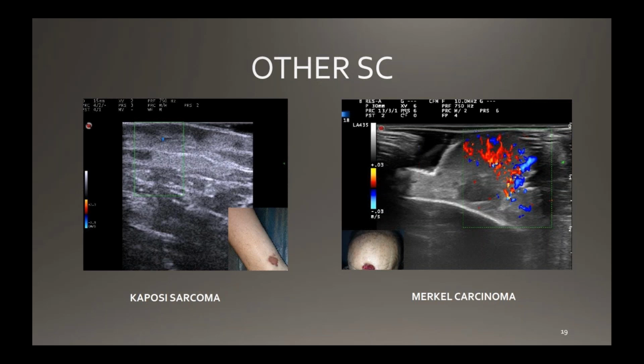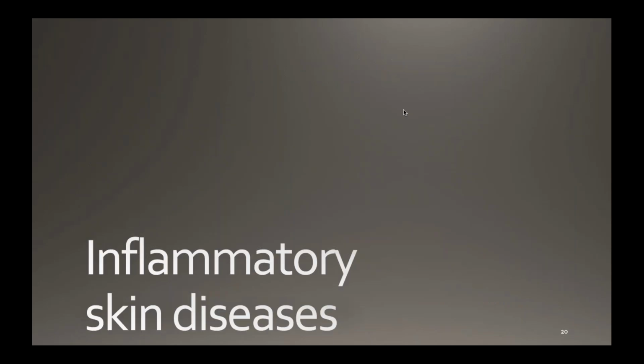That's another thing you can offer to your dermatologist. As I was telling, the important part in this webinar, maybe not the images, or maybe not the real sonography, or the things that you have seen from the seminars by Jimena Bosman and Dr. Catalano, but how to convince your dermatologist that ultrasound may be of usefulness to them.